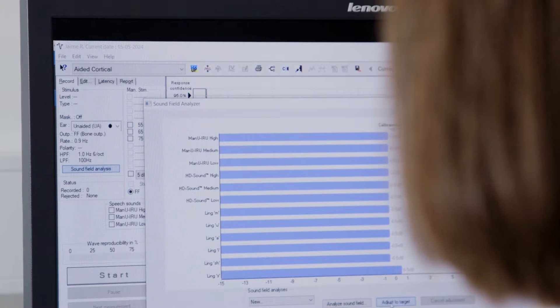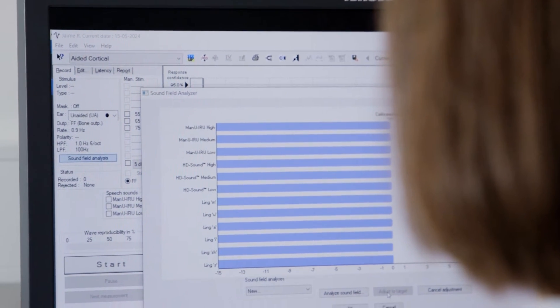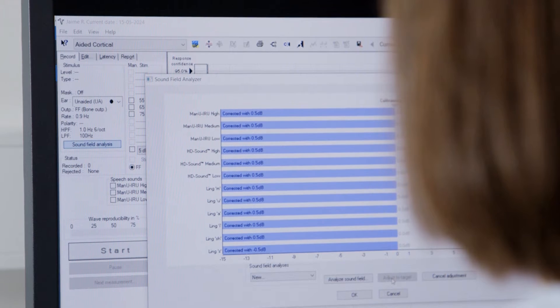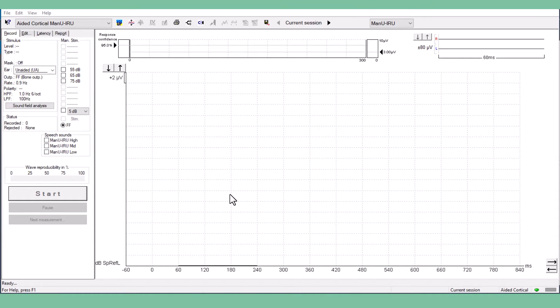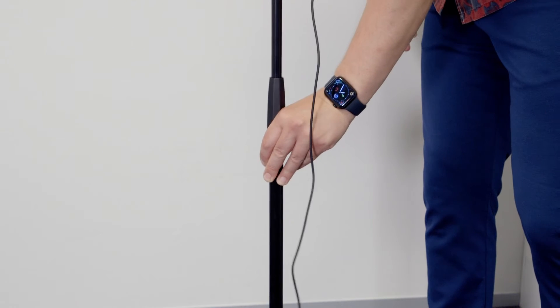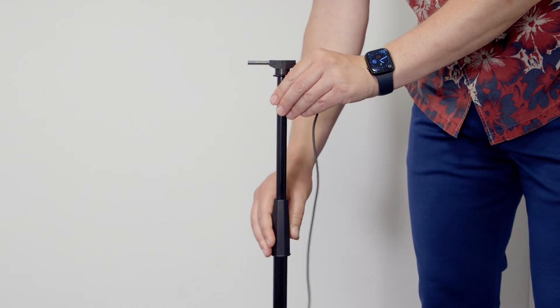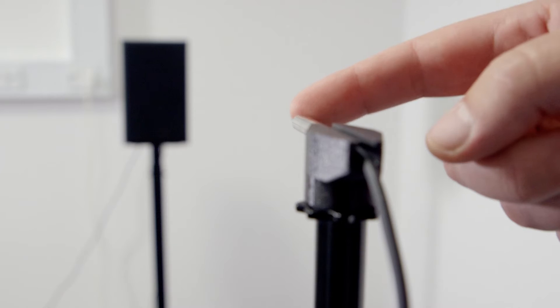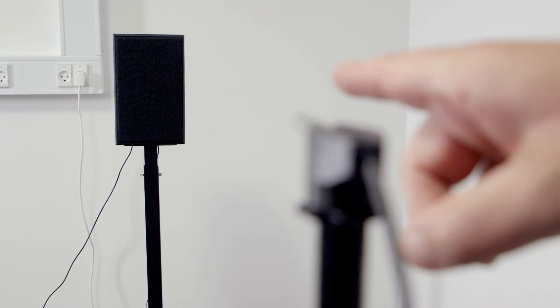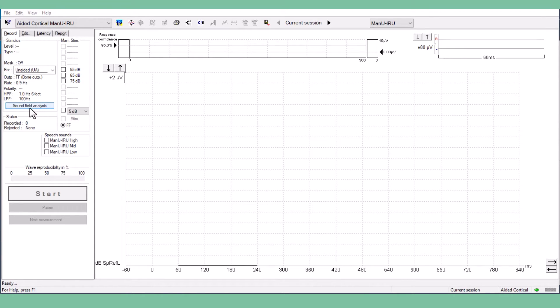We recommend running the Soundfield Analyzer before each aided cortical test you perform. To use the Soundfield Analyzer, first open the aided cortical module in your Eclipse software. Place the ambient microphone where the patient will sit. The microphone should be level with the patient's ear. Click Soundfield Analysis in the menu on the left.